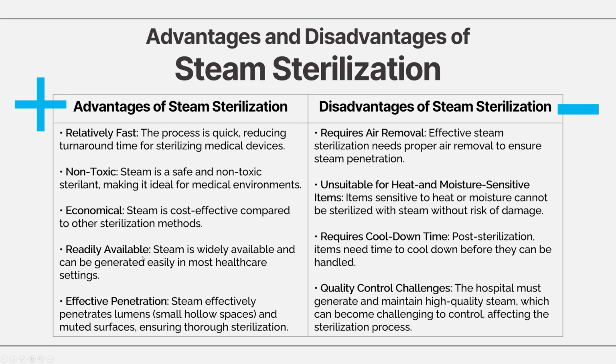It's readily available. Most healthcare facilities already have the proper infrastructure to produce steam. So they have boilers, generators, making it convenient and accessible. Unfortunately, older healthcare facilities, while they have the boilers and generators in their infrastructure, some of them don't have the proper water treatment infrastructure to actually release clean steam. So there is also that factor to keep in mind.